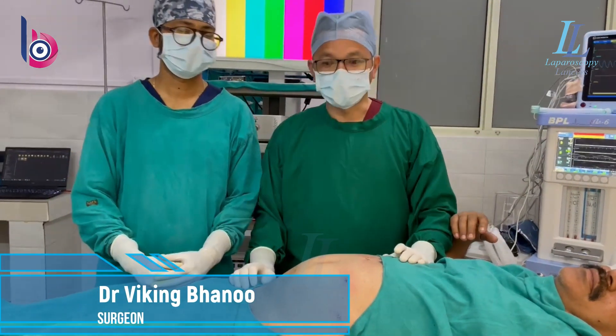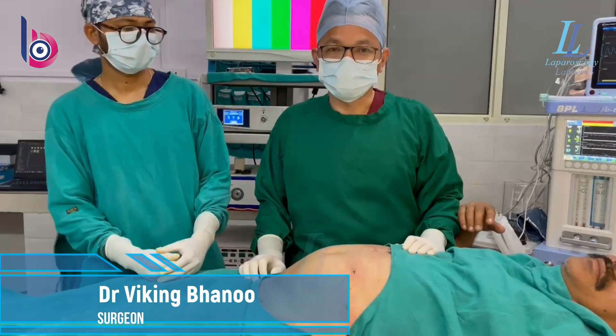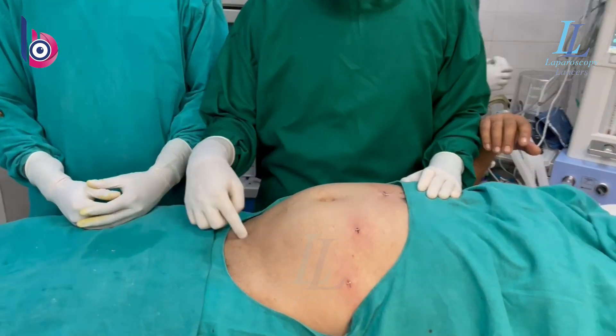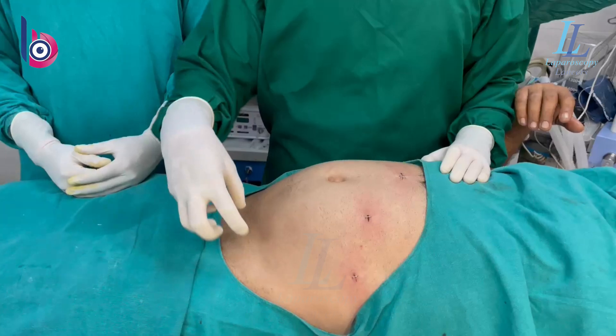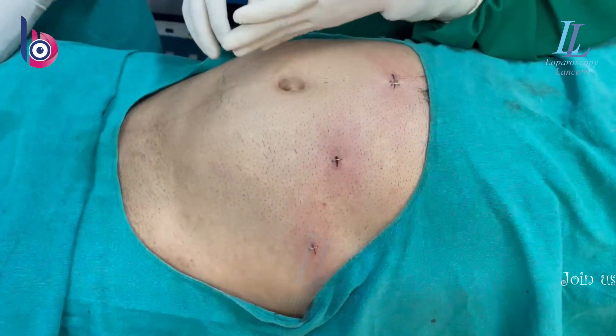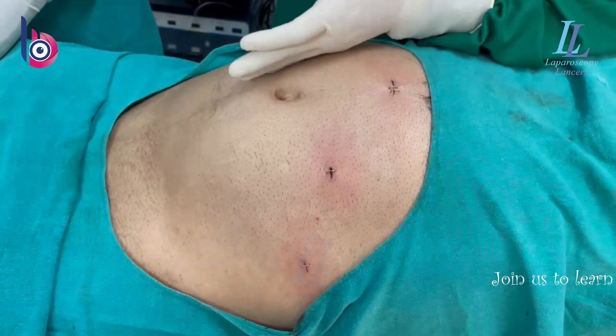My dear surgeons, today we have done a laparoscopic inguinal hernia surgery — a trans-abdominal pre-peritoneal repair for a left inguinal hernia. I didn't go for a TEP repair. As the hernia is on the same side, it sometimes becomes difficult to negotiate it on the opposite side, as TAPP generally is on the right-hand side.